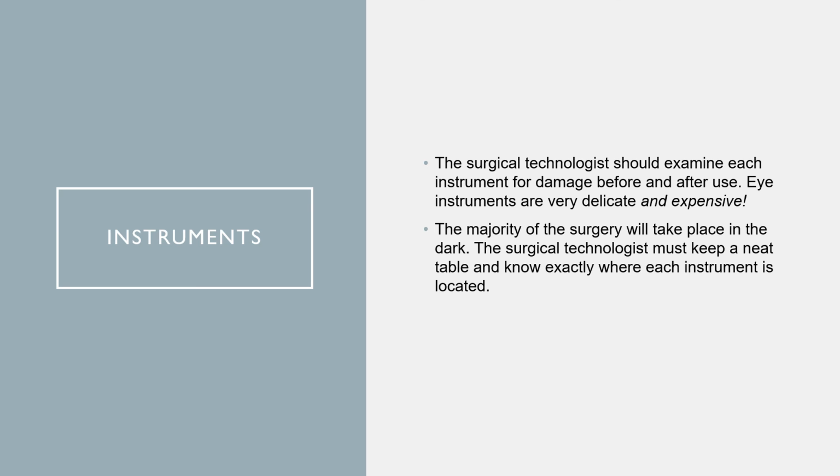The majority of the surgery is going to take place in the dark, so it's important for the ST to keep a neat table and know exactly where each instrument is located. Once we use an instrument and we're done using it, it needs to go back to its original position. Remember, a lot of times we'll be working under a microscope and you won't be able to look away. So you do need to have a good grasp on where your instrumentation is located on your Mayo and back table.